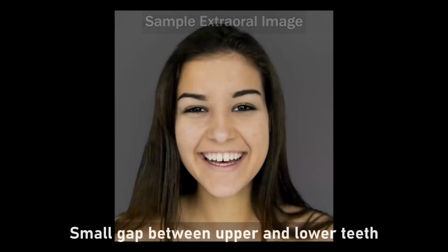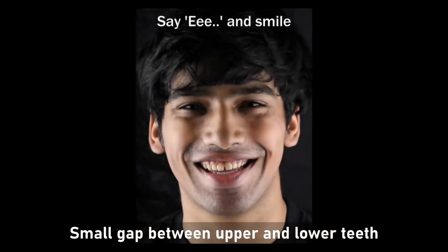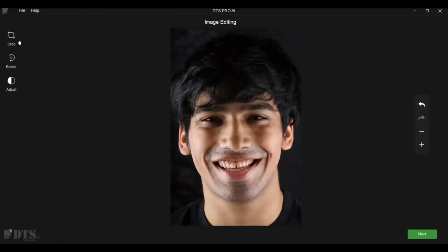Ask the patient to stand upright, look straight ahead, and maintain a slightly open mouth position. For a natural wide smile, ask the patient to say the letter E and smile wide. For most simulations, a single extraoral image is sufficient. We'll cover how to use retracted images in a separate tutorial.